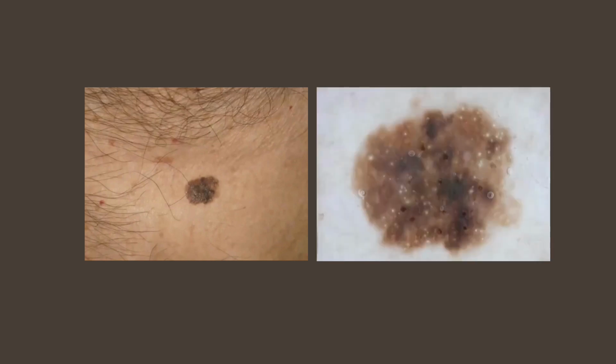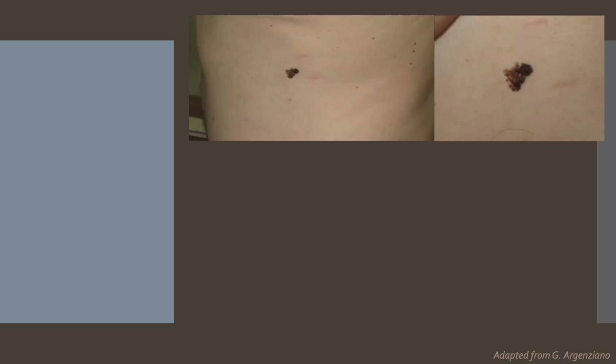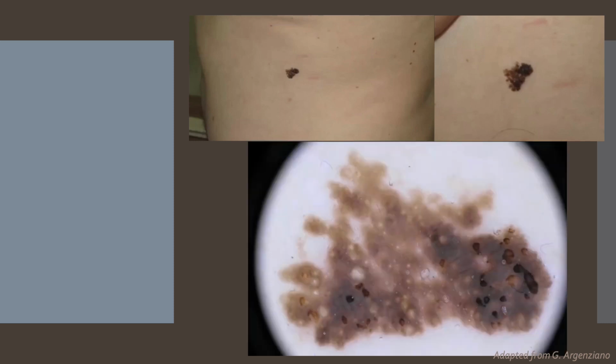Another large asymmetric looking skin lesion with border irregularity and color variation, but just a seborrheic keratosis on dermoscopy. Oh, look at this one. A very pigmented, asymmetric looking lesion on the right flank of this patient probably meets the whole ABCD criteria of melanoma. But this was actually a pigmented seborrheic keratosis on dermoscopy. So the patient was discharged. So dermoscopy saves unnecessary excisions.